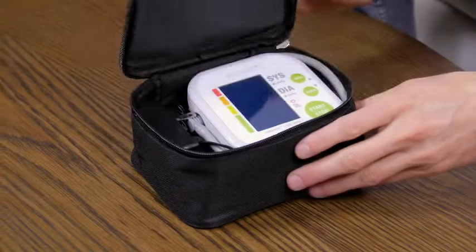A simple, accurate blood pressure monitor with everything included? That's what we're checking out today when we open this box. Stay tuned.